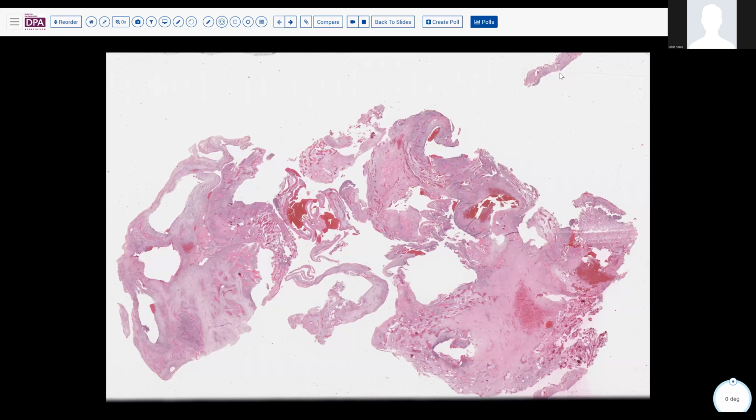So thank you so much for joining us for this session. I've prepared a number of cases with kind of interesting differentials, I think. And did you have a chance to look at the slides beforehand? Sorry. Okay. Unfortunately. Well, the link for the slides, of course, will be available, and you can look at them.